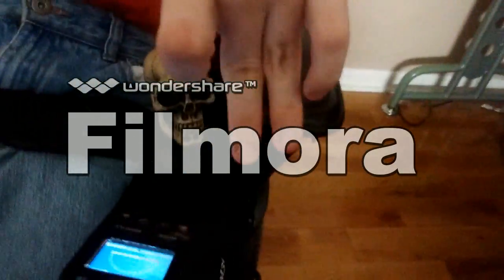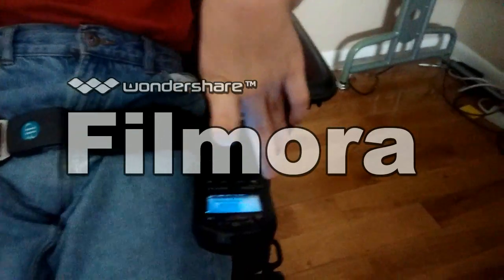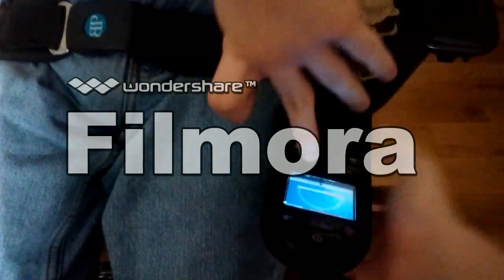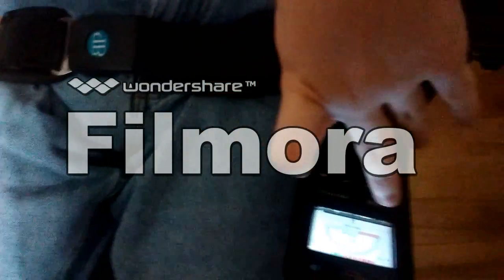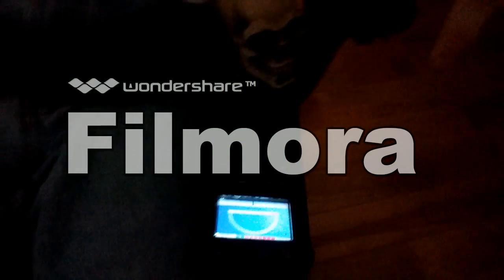On my controller it's probably a little different than everybody's, but basically your functions are the same. You've got your profile button, which is basically your high-low range for your wheelchair. Where it says 2 and normal, that is high gear. And when you get into 1, that is the low side of the transmission. Now let's talk about mode.